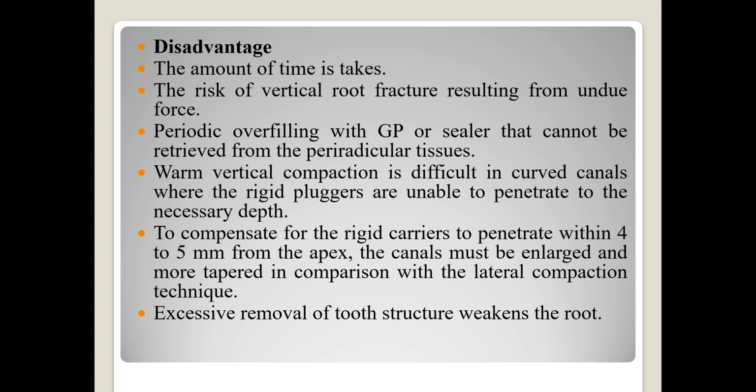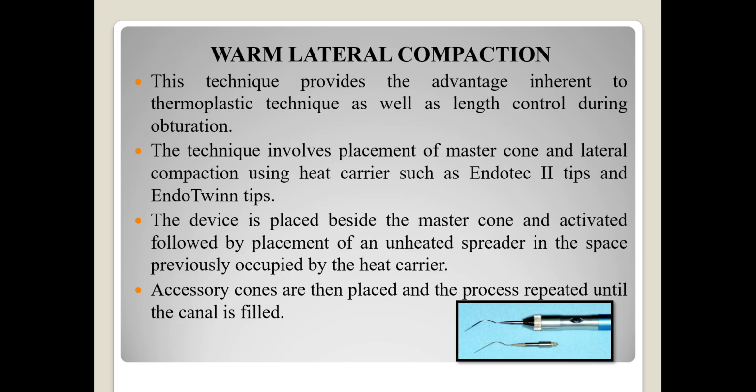Warm vertical compaction is difficult in curved canals where the rigid pluggers are unable to penetrate to the necessary depth. To allow the rigid carriers to penetrate within 4 to 5 mm from the apex, the canals must be enlarged and more tapered in comparison with the lateral compaction technique. Excessive removal of tooth structure weakens the tooth.